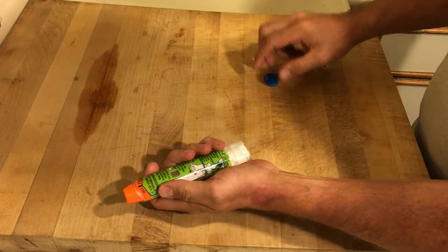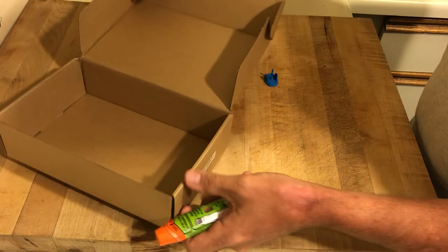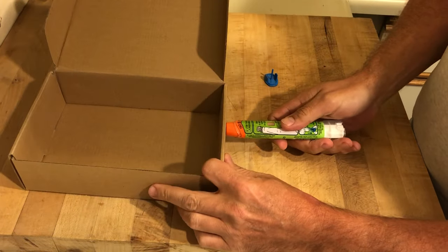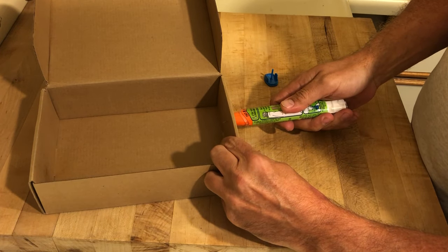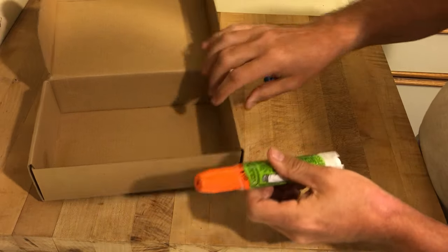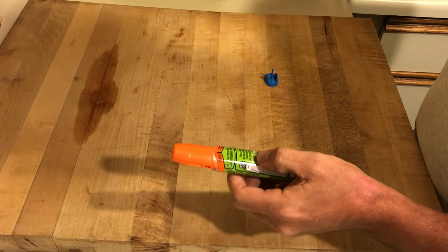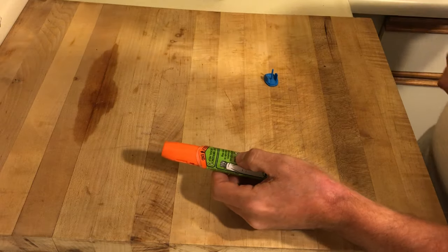When you push the EpiPen against the patient's leg very quickly, the dose comes out and the EpiPen closes, so now you can't use it anymore. Your patient got their first dose. We need to give them a second dose because they're in anaphylactic shock, and you need more EpiPen when you're out in the wilderness.